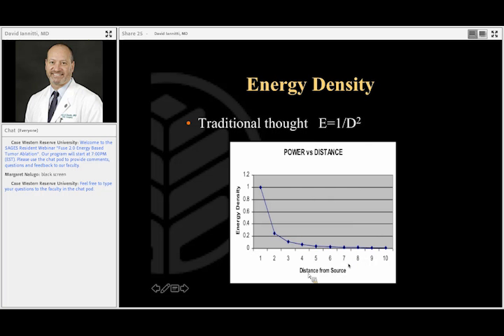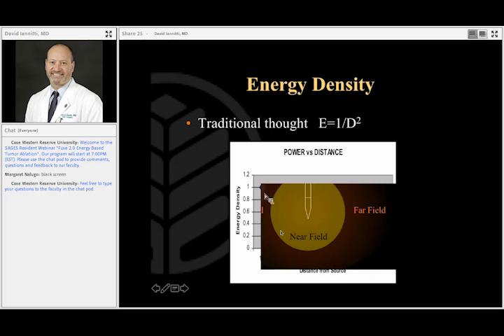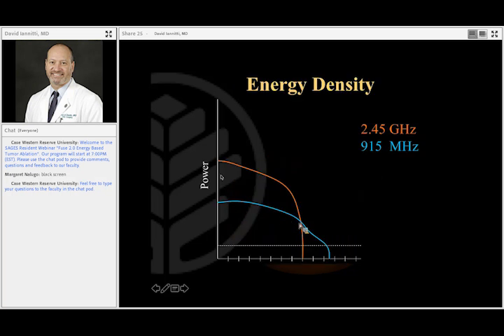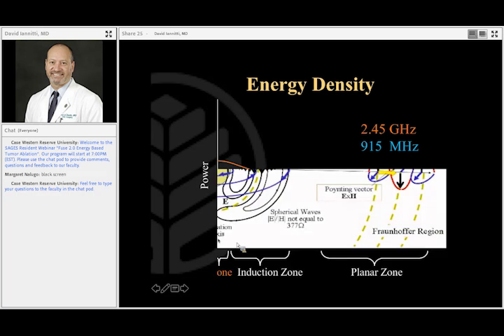But what we notice clinically in microwave is that you actually have a microwave near field where the energy density through that near field is actually consistent, and at a certain point it falls off. Well, why is that? So again, this is just different frequencies, and you can see the energy density is fairly consistent for a certain distance, and then it falls off. It falls off sharper with a higher frequency. Well, this is where fun with physics comes in. So it depends on how that wave is created.